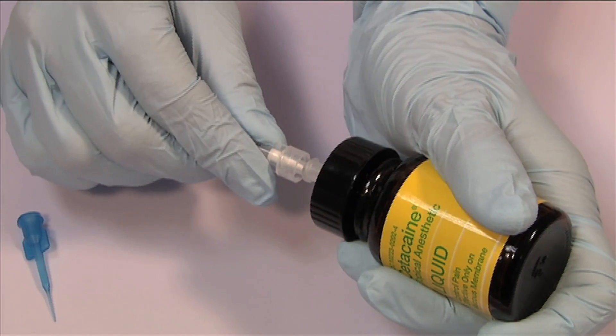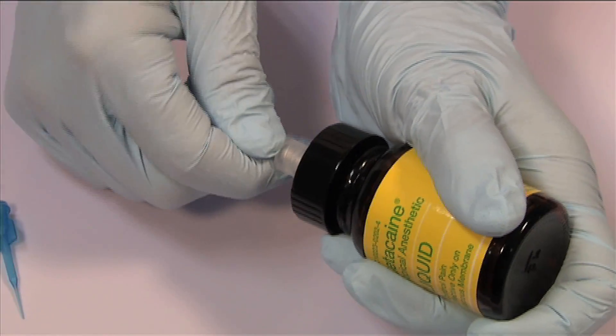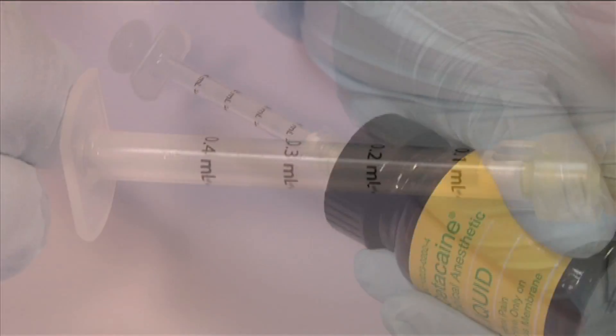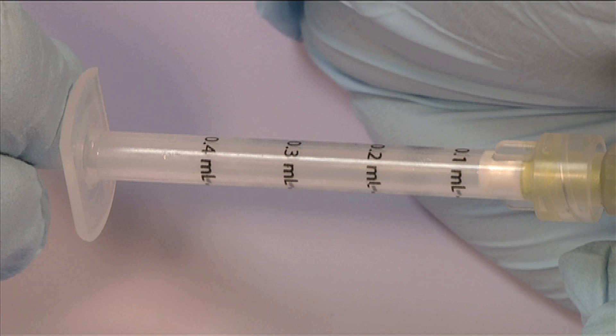Attach a delivery syringe, locking it into the luer lock port. The syringe is uniquely graduated in increments of 0.1 milliliter, up to the maximum recommended dose of 0.4 milliliter.